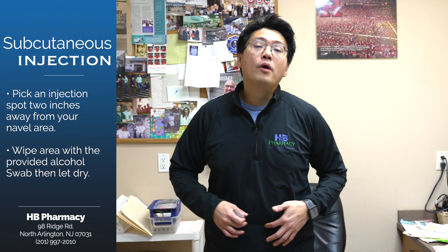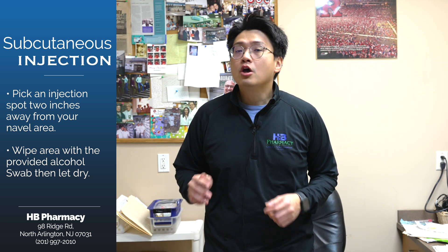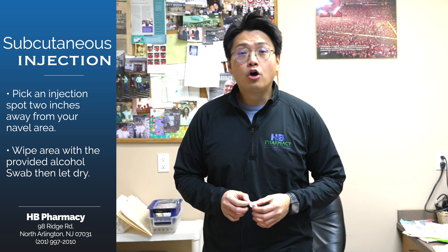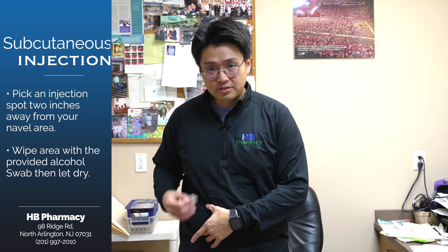Now that we have drawn up the dose, we are going to inject it. I recommend two inches away from your navel area, whether it's left or right. You are going to use the alcohol swab on your bare skin. Make sure you alcohol swab either side and let it dry for a second.